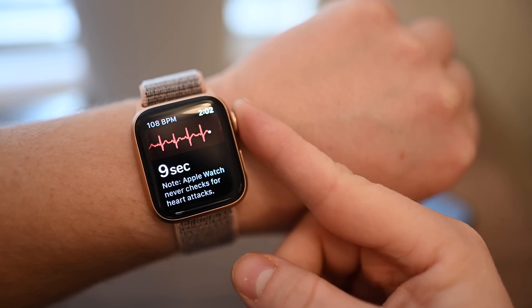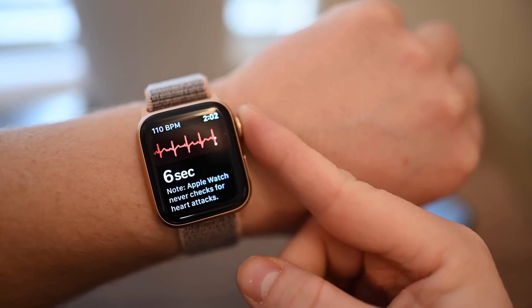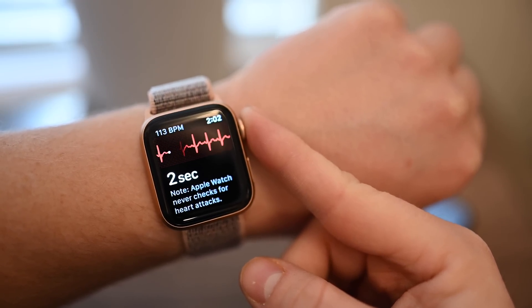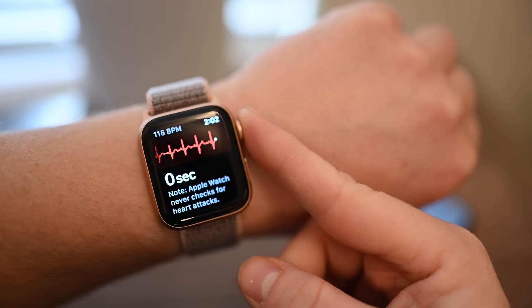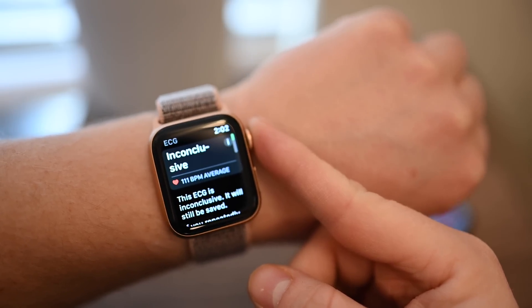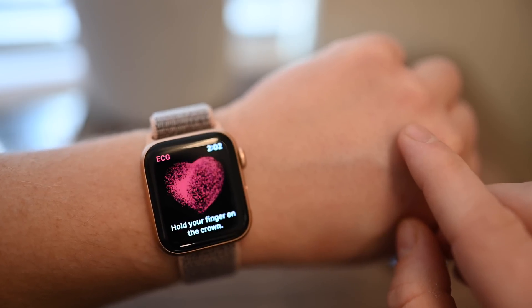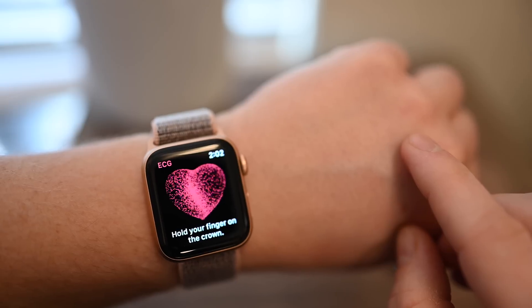The first time we took the ECG on our new Apple Watch after installing the update, we got inconclusive. It doesn't tell you a lot, and it does warn you that if you get this reading quite often, you should probably double-check with your doctor to make sure everything's okay. Luckily, after repeating the test many times while making this video, we got a normal sinus rhythm every other time.